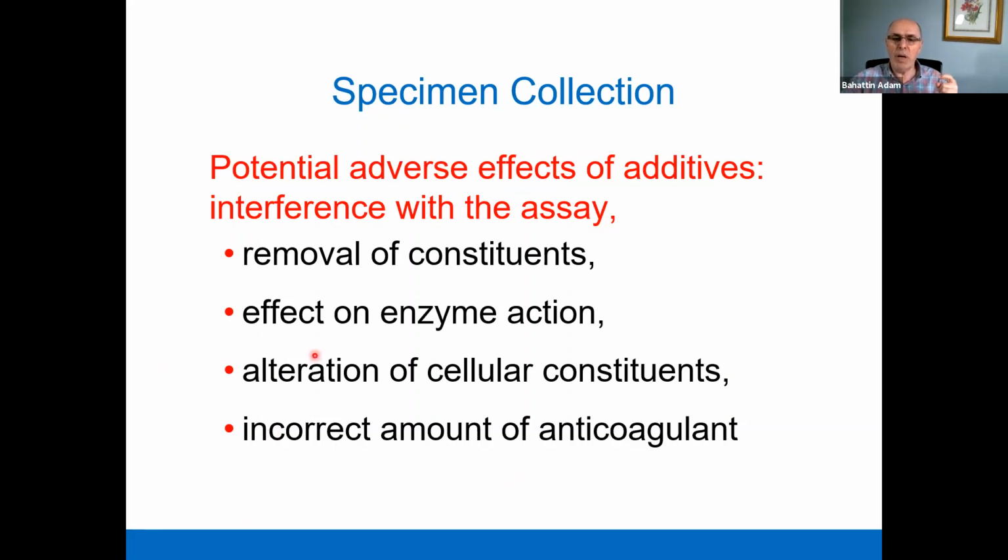They may remove constituents from the blood, which results in lab errors, or some of them may affect the enzyme activity. If you are going to measure the kidney enzymes activity, they may be affected by additives or anticoagulants. We have to know that.